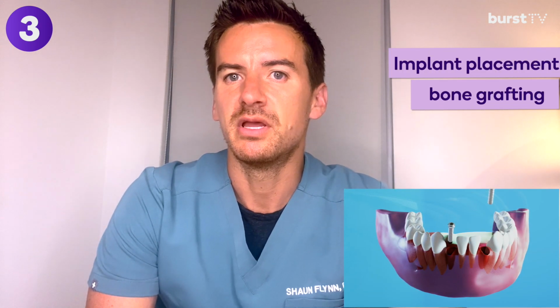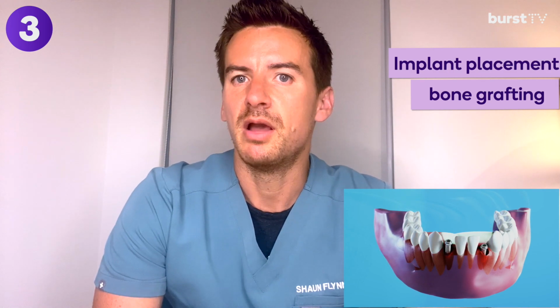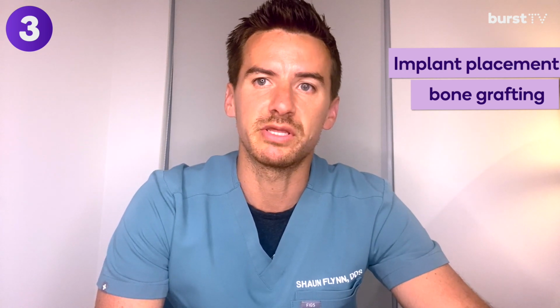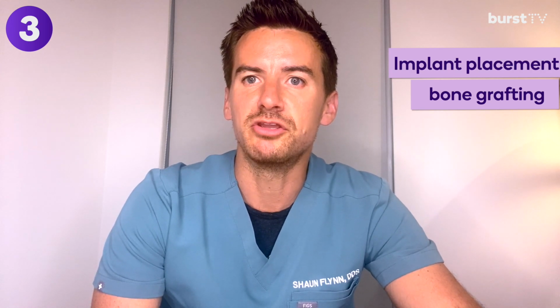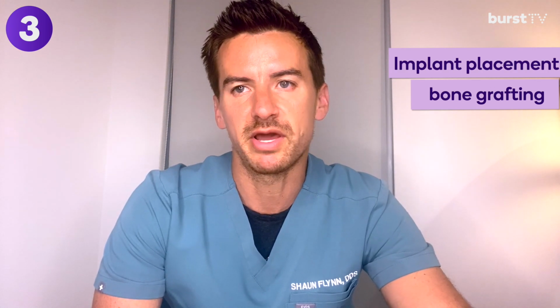Okay, step three. This is actually the dental implant placement and a bone graft if it's needed. Now, if a bone graft is not needed, then the implant can be placed right away. But if a bone graft is needed, then this can be done before placing the implant or even during the implant placement. If the bone graft is placed before, then usually the patient will have to wait several months for the bone to strengthen, and then the dentist can go ahead and place the implant. After the implant is placed, it can take about 3 to 6 months for the next step, okay?